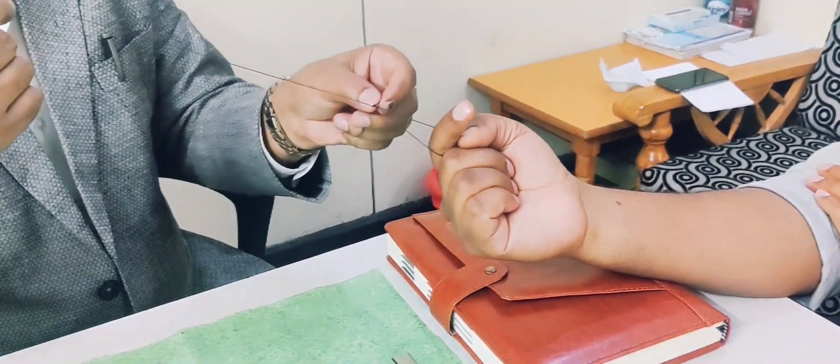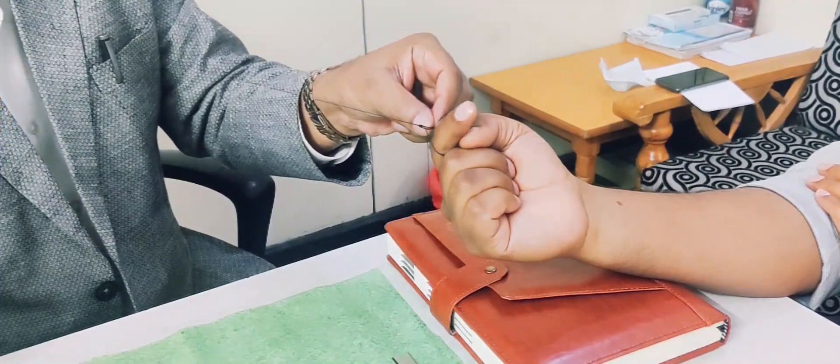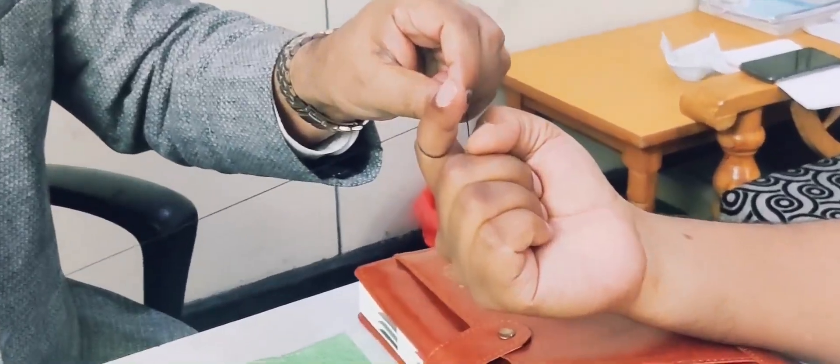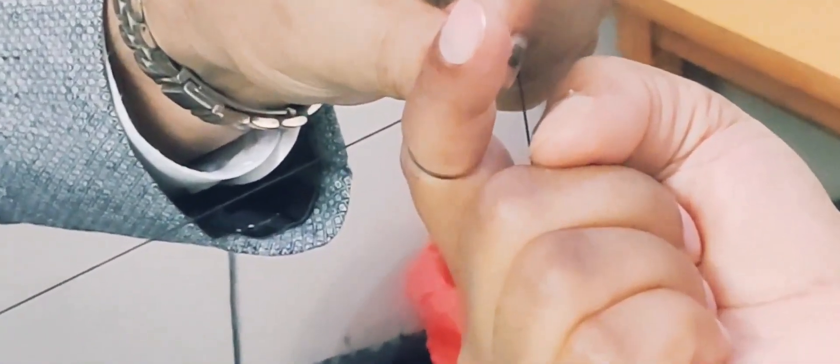And then you can use a knot pusher and then you see how it is moving there. If you want, you can come close to see on the finger that the pressure effect caused by this knot. Can you show the camera near to the finger that the pressure effect is there.